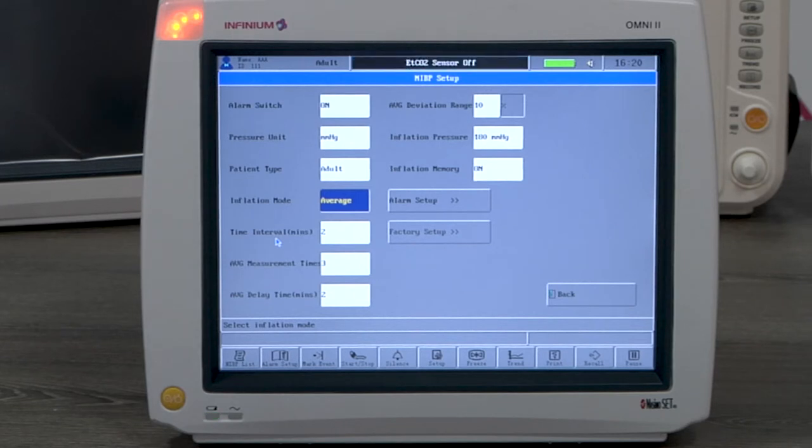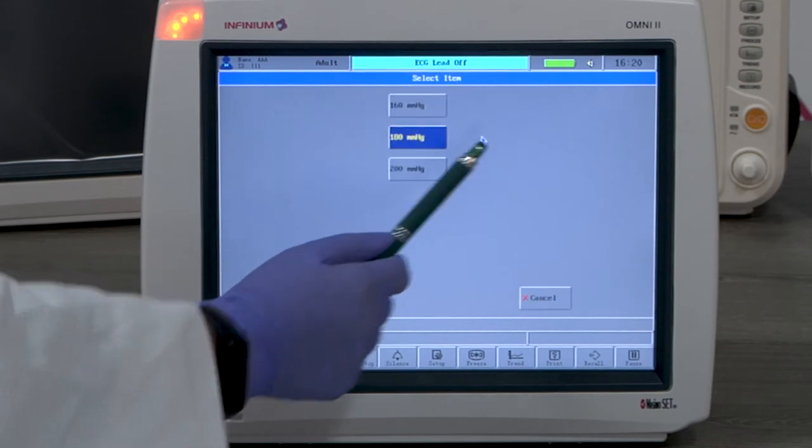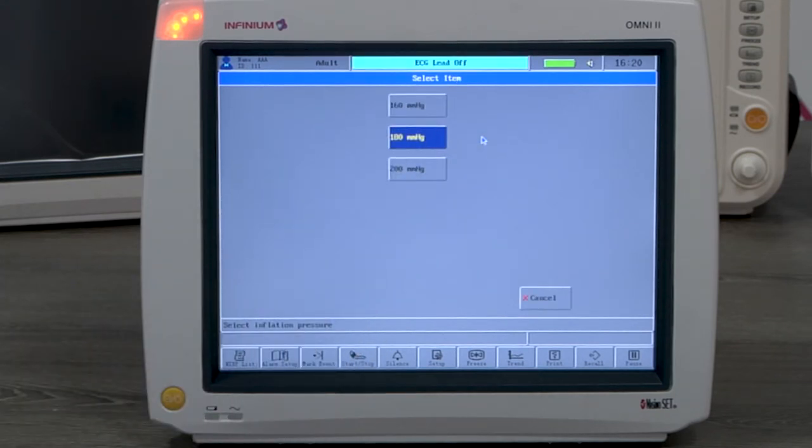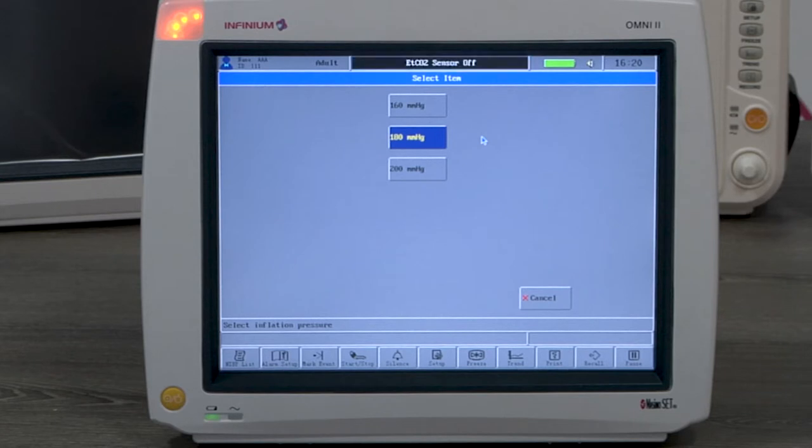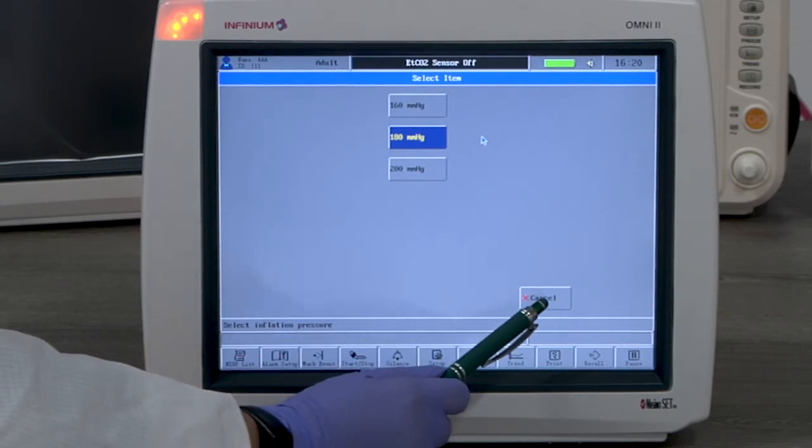The inflation pressure is the initial inflation pressure. The default is 180 and it can be set to a lower or higher value depending on which one fits better in the clinical use.